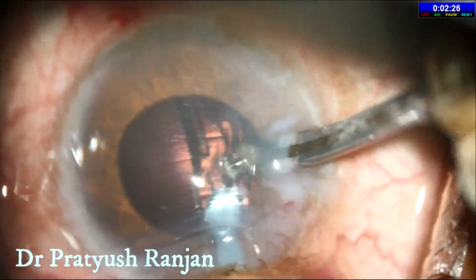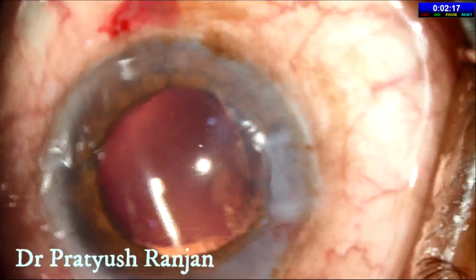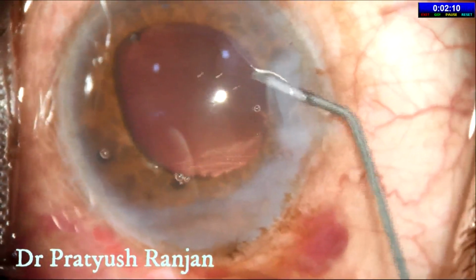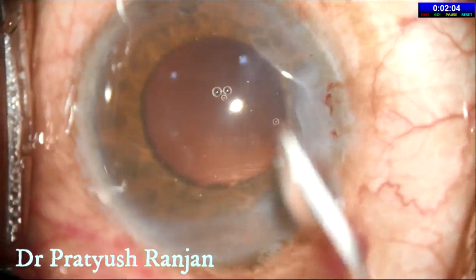You can use a PMMA lens also. It depends on patient's choice. They want sometimes better lenses, and sometimes it's difficult to argue with them that PMMA is better than most of the foldables. And one more myth, you can implant a multifocal or something like that in SICS also. But you should be comfortable with your SIA.